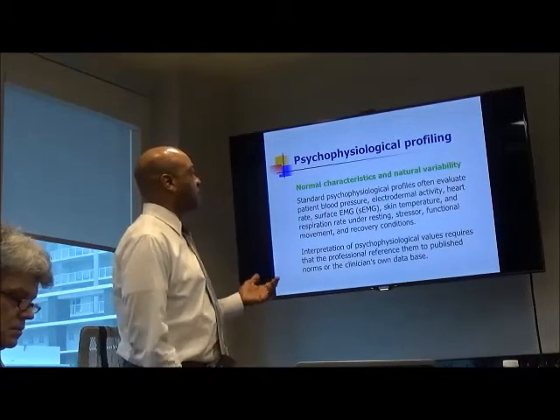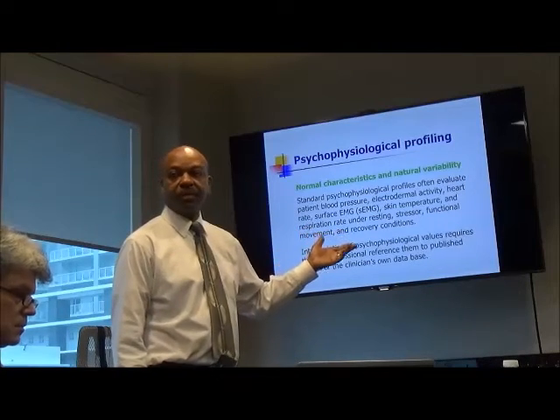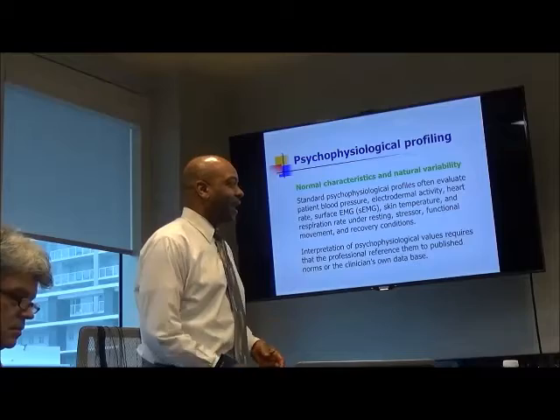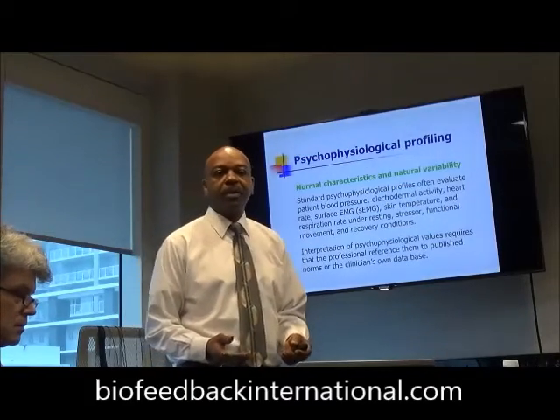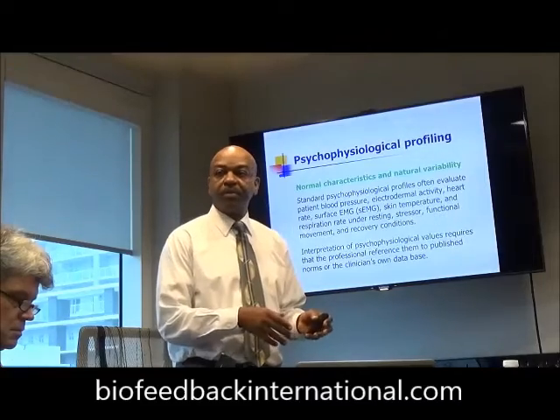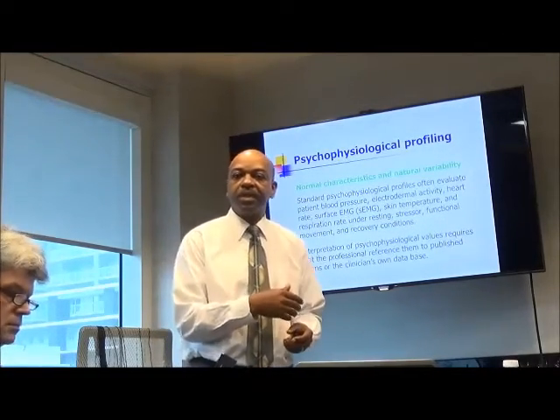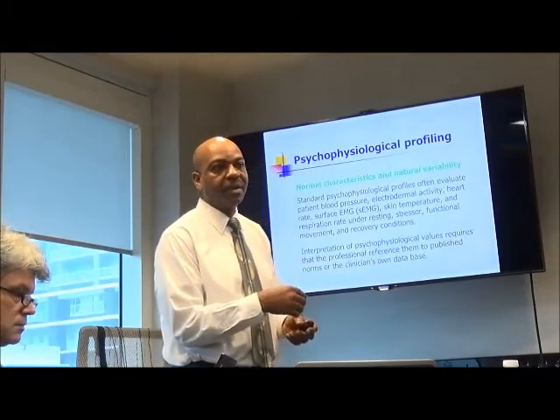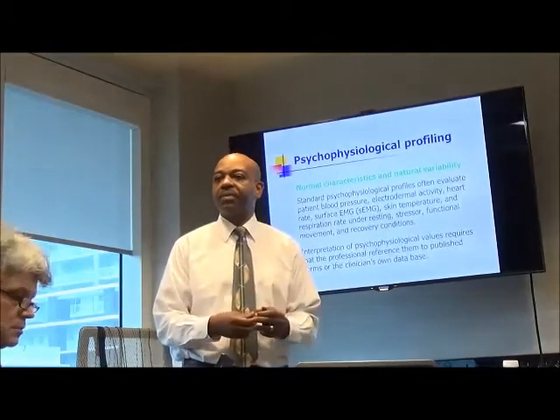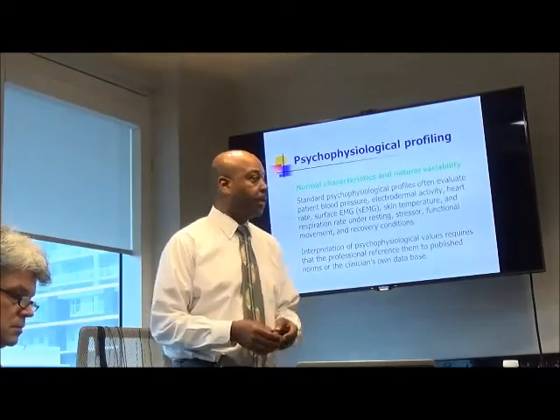what it is. So basically we're going to be measuring many different things at the same time. And for the most part, I tend to do the peripheral modalities by themselves. Some people would also include EEG with the stress profile. I usually don't do that. If I'm doing EEG with a person, I would do a different kind of assessment with that.